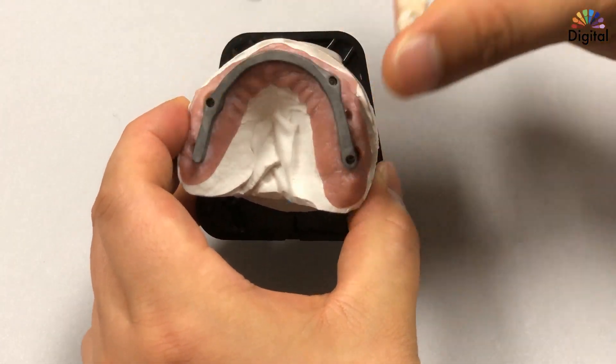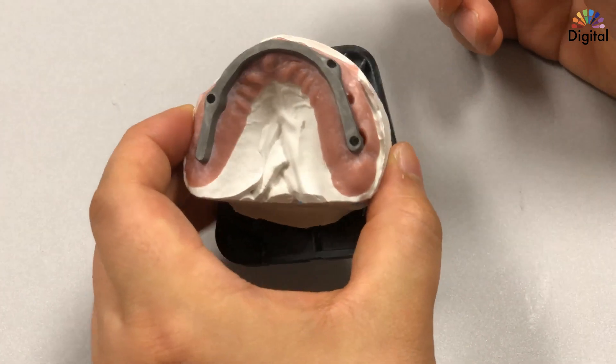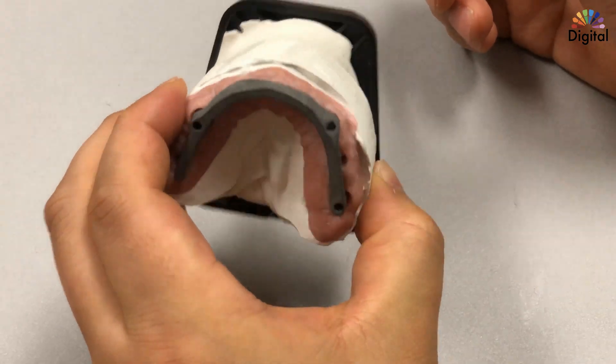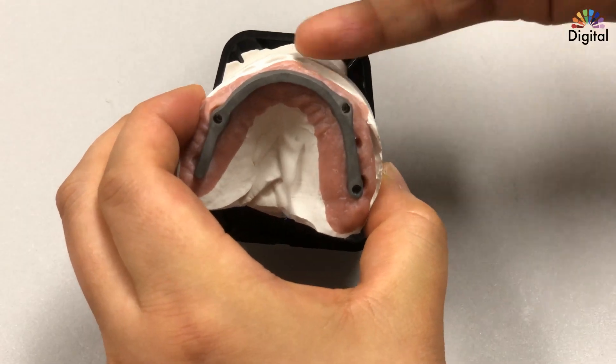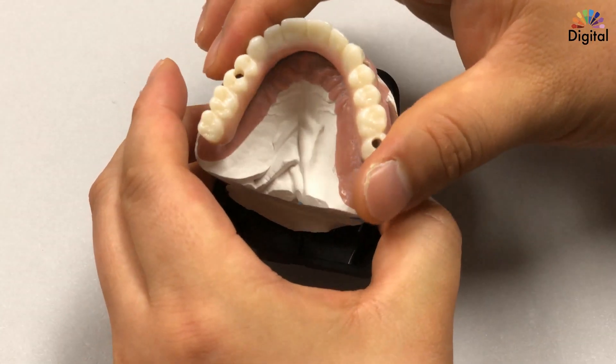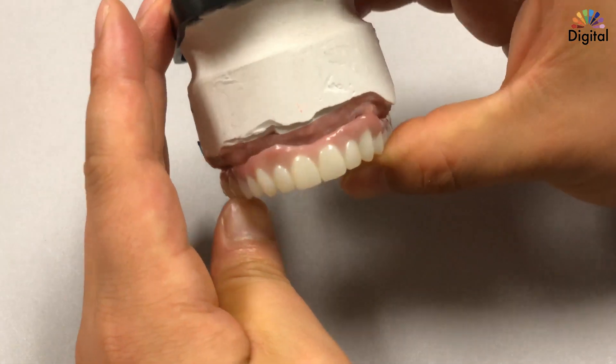Underneath we have the titanium bar — no shine at all. After milling is done I sandblast it to create retention. Of course, the bottom underneath is all high-polished. Now I'm going to do the cement and we have the final result.